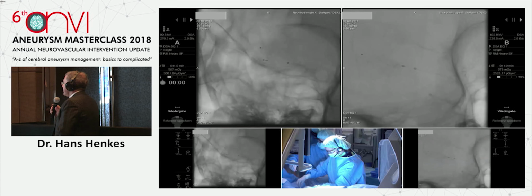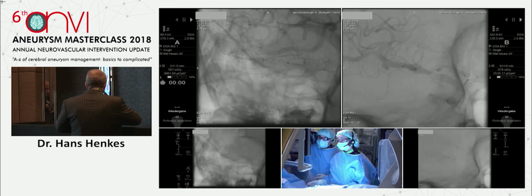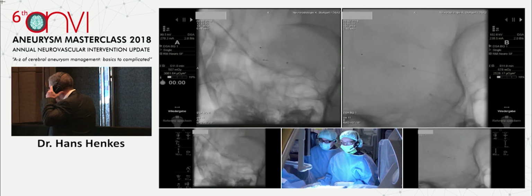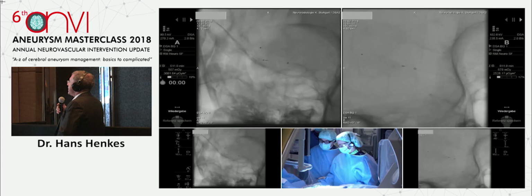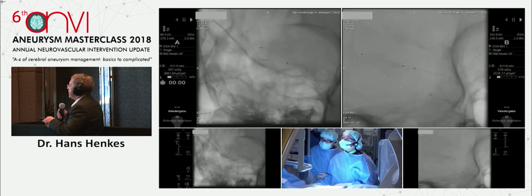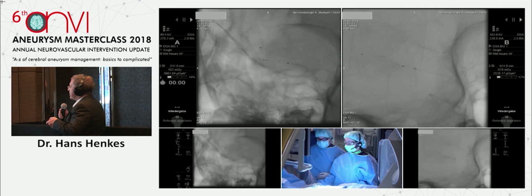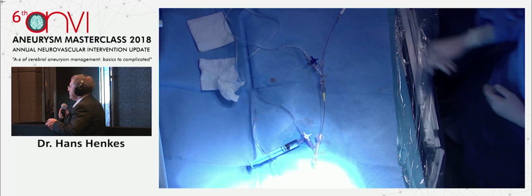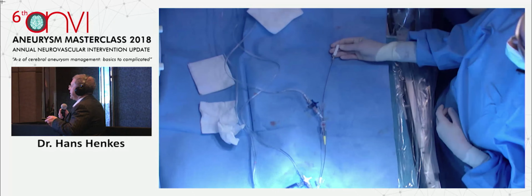Can I have the micro? Yeah. Wait, do you hear me? Do you hear me? Okay, good. So Marta will now detach the system. Maybe go with the camera on the table, right? Could we see it on the table?